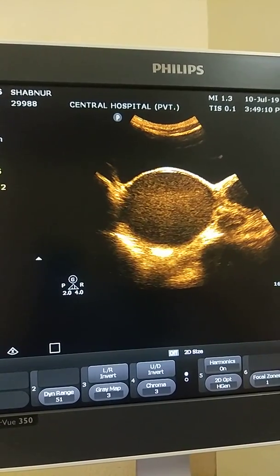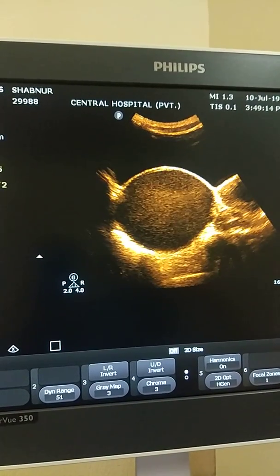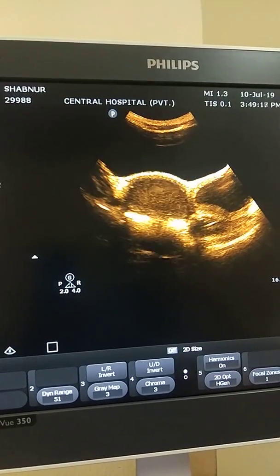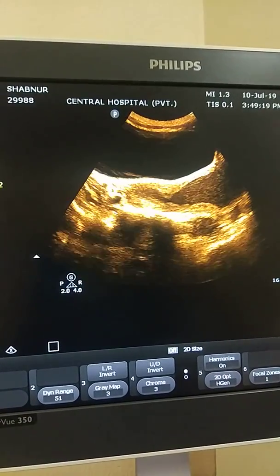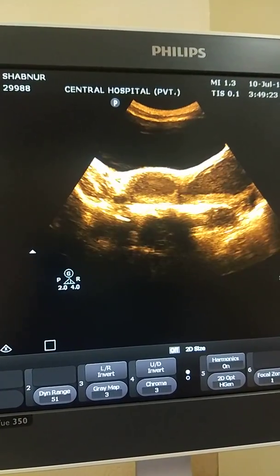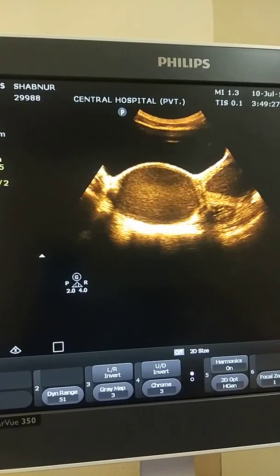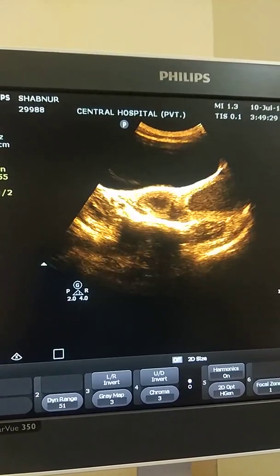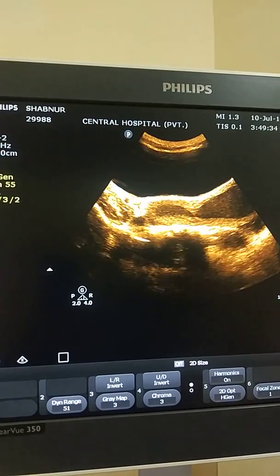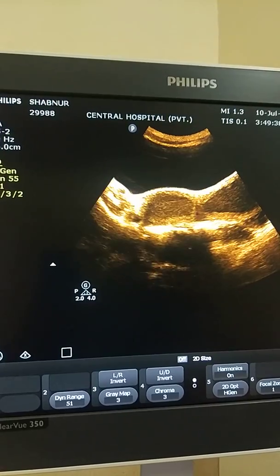At first I thought that it is an endometriotic cyst. But when I found the connection between these two hypoechoic areas, I confirmed that this is hematometrocorpus.